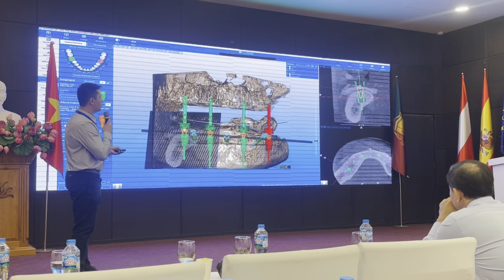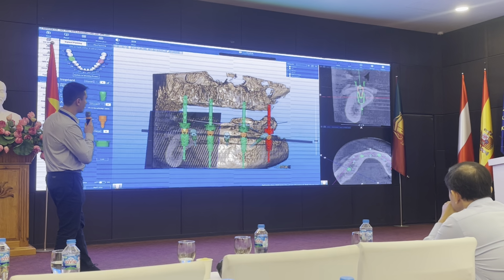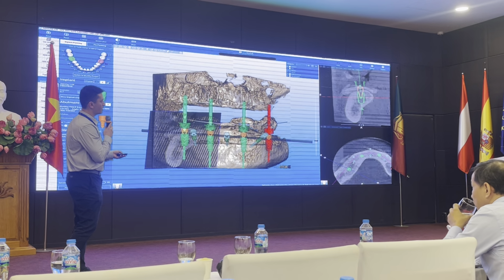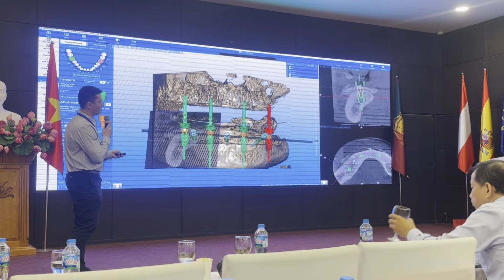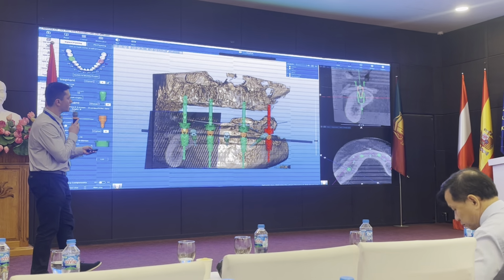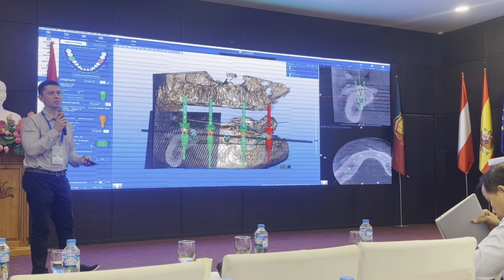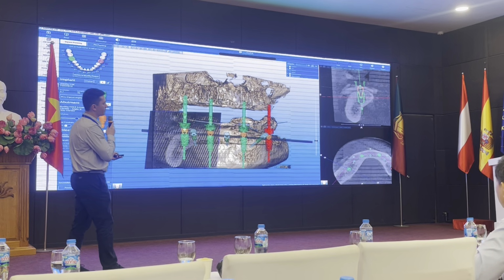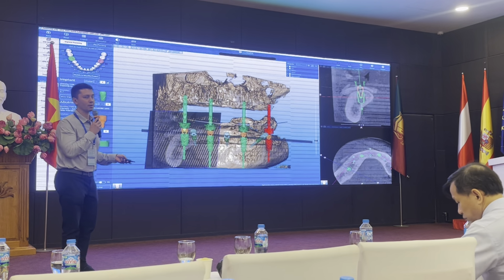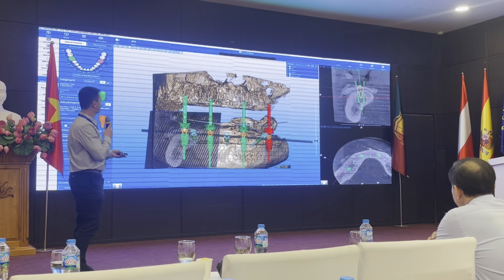So this one right here, because we know on a surgical guide, we know where this lingual concavity is right here. This is on his lower right molar. Without a cone beam and without a surgical guide, we would not know where that concavity is right there. And so we can avoid a complication here, because it would be easily possible to drill straight through this bone right there. If we drill through that bone, we increase our complications, have a perforation on the lingual side of the mandible, and potentially damage vital anatomy on the floor of the mouth. So because we have a surgical guide, this is a much, much safer procedure.